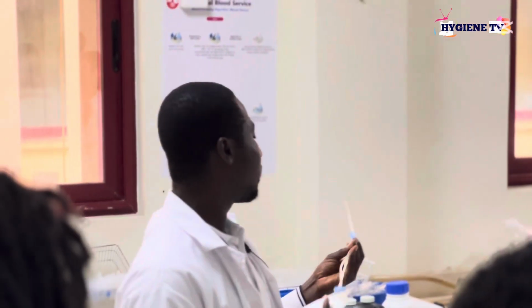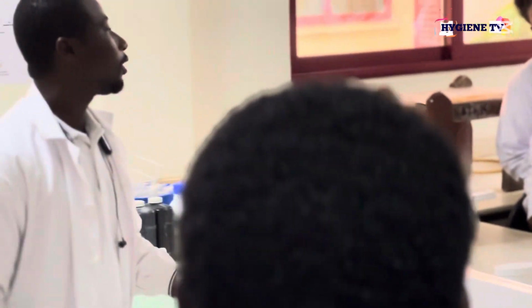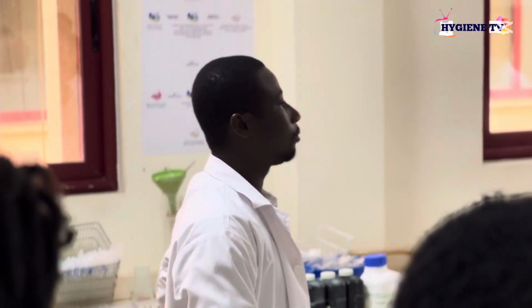When you collect blood in the right kind of anticoagulant and you leave the blood at room temperature, that blood after 24 hours is useless and cannot be used again. If you leave it on the bench like this for 24 hours, it's useless, because this blood bag is semi-permeable.